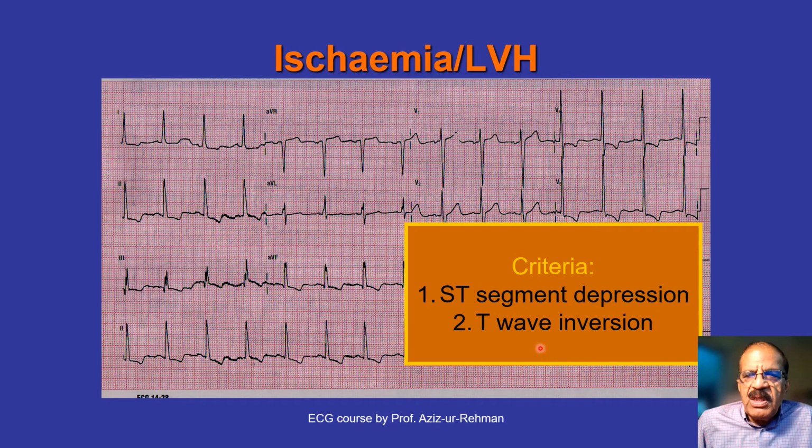ST segment depression, T wave inversion. I have already said it and I'm going to say it again: in the majority of patients with exertional chest pain, resting ECG is expected to be normal.